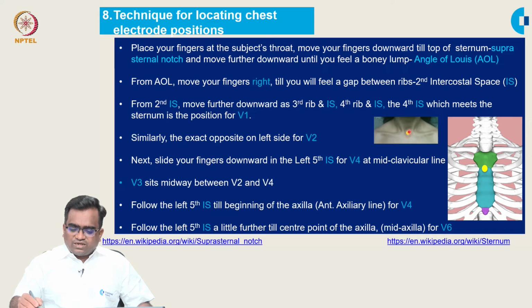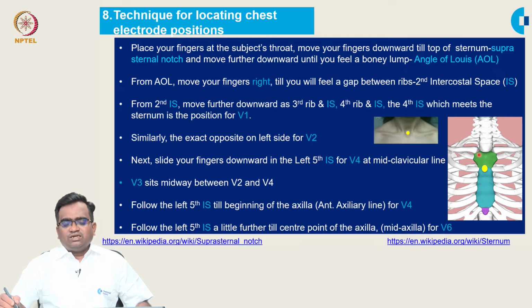After locating the suprasternal notch, the healthcare provider has to come downward along the sternal bone. It contains three parts: manubrium sterni, body of the sternum and xiphoid process.